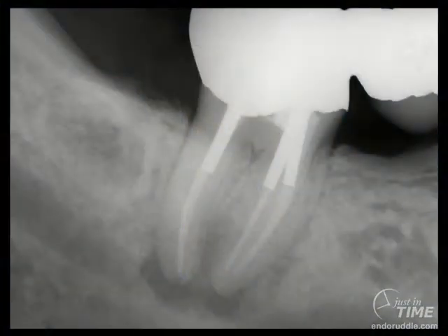If we look at a case of this mandibular second molar posterior bridge abutment, you can notice there are three posts apparently in three different canals. Look at the mesial root carefully and notice how broad it is mesial to distal, especially at about mid-root.